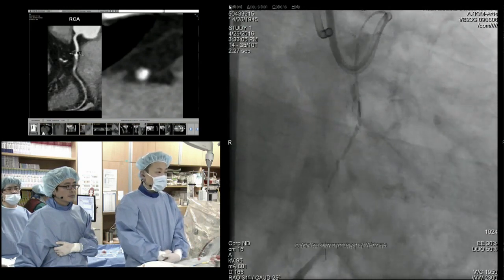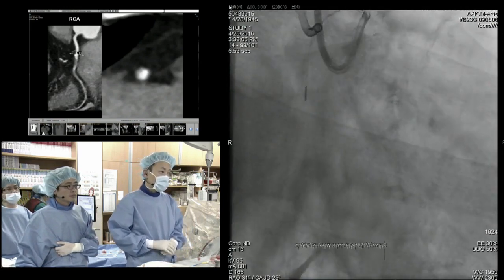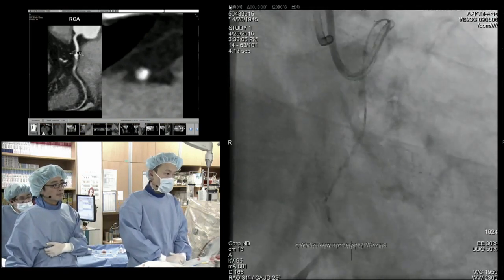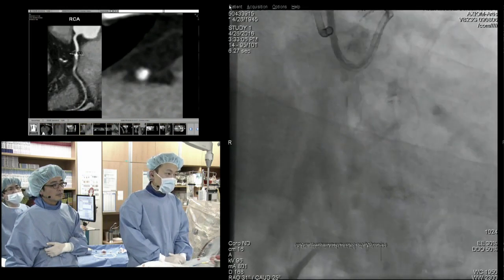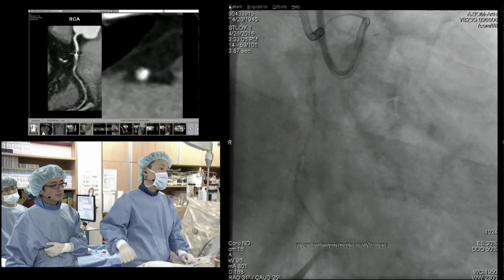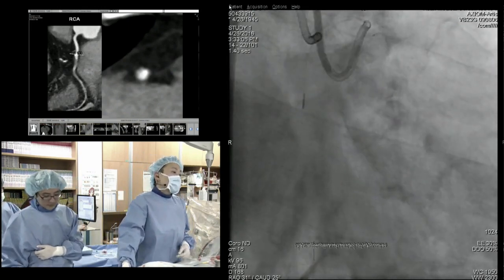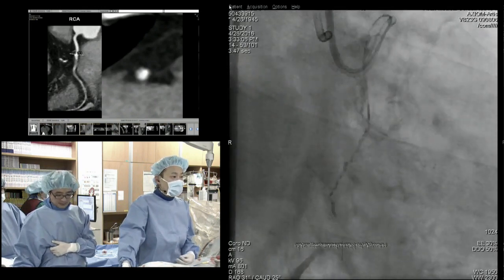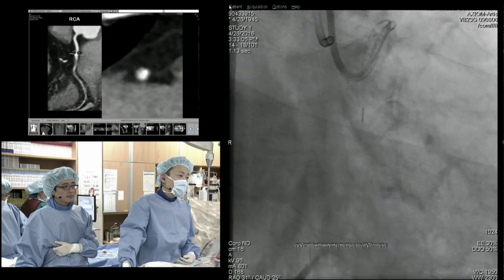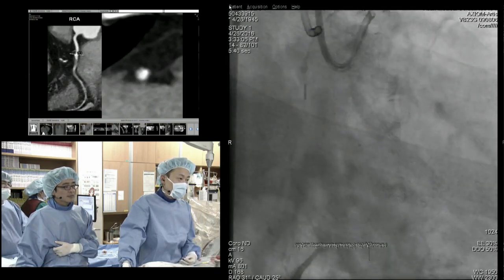In our view, there is some zigzag point just distal of the caliber. So I changed the wire from the XTR to the SO03. SO03 is very soft, and in addition is very safe. And also sometimes we can track this kind of very tricky morphology channel.